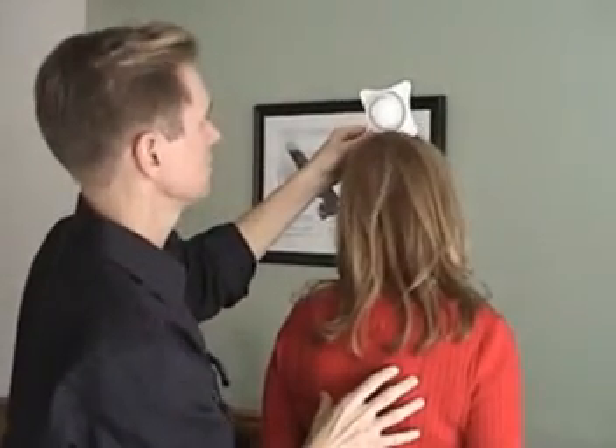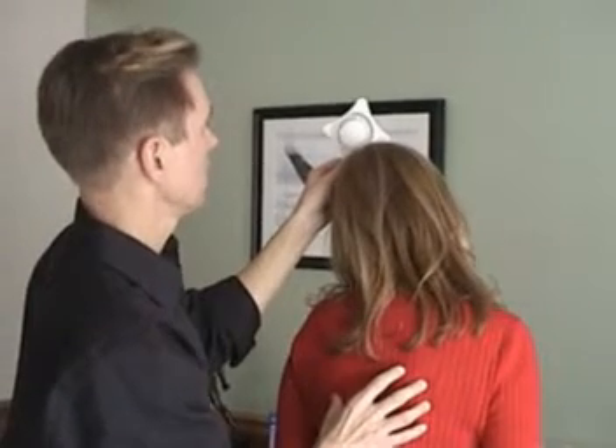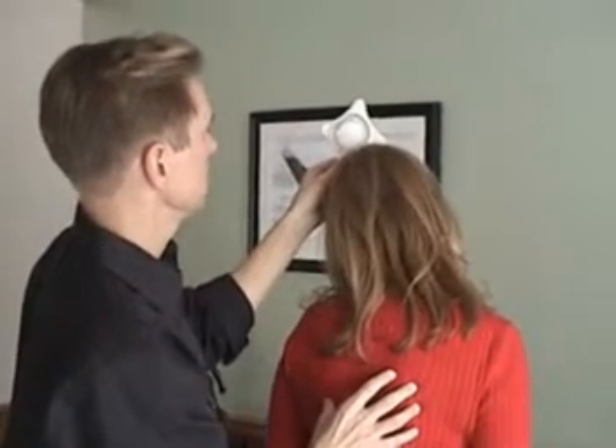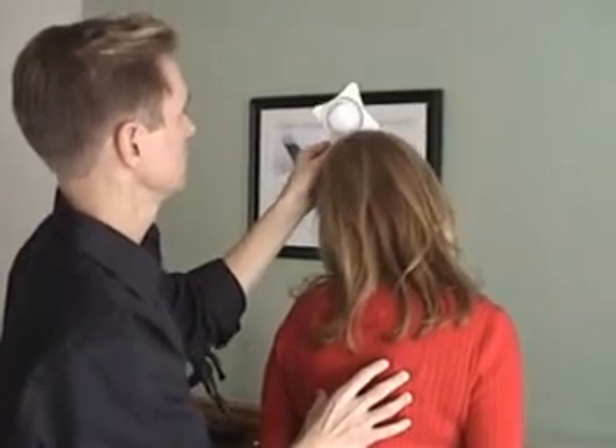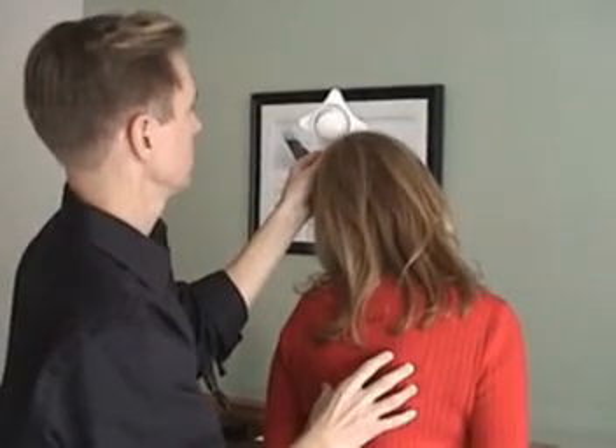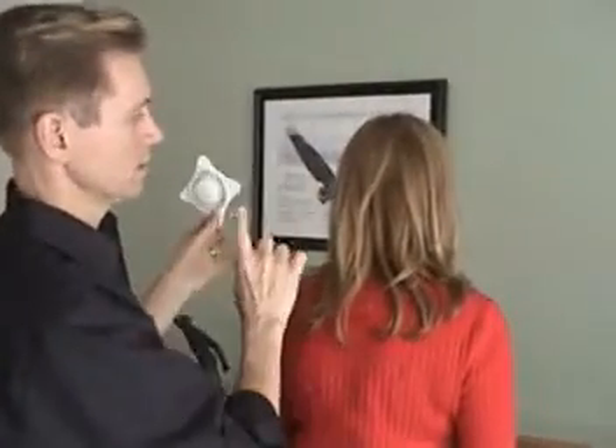Then go to the left. She's a little less — about 35 degrees going to the left.